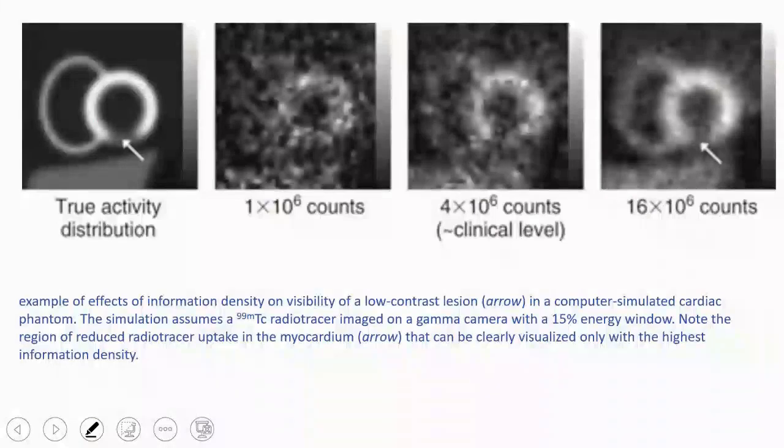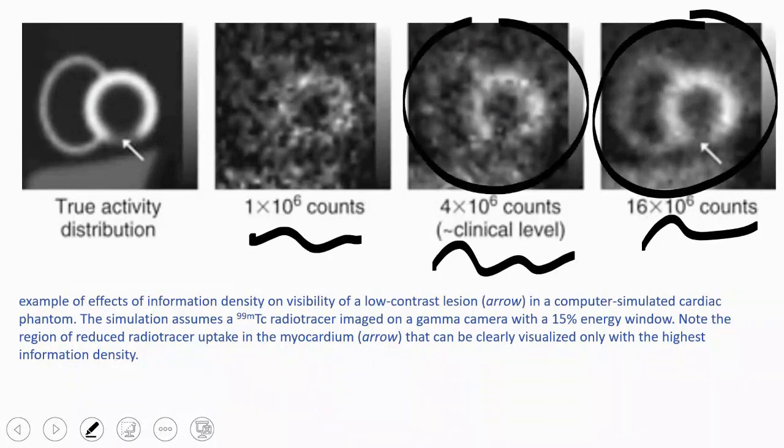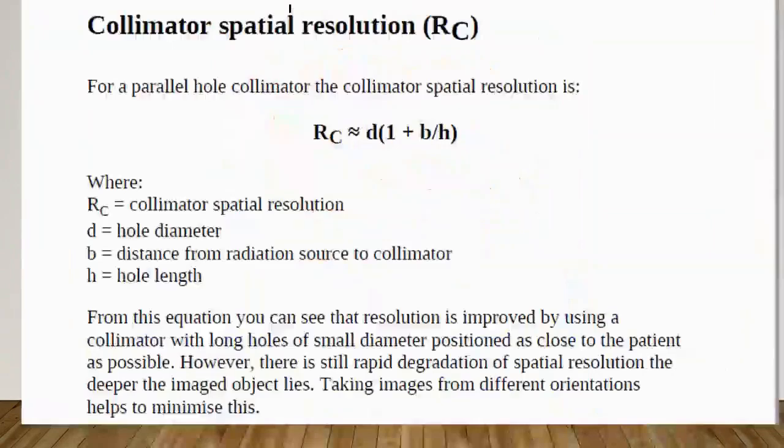The same idea applies. If there is a problem with the sensitivity, then the counts produced by the detector will be weak. I will show you the image that you created. Here with the high counts is a quick image. Here with the closest sensitivity, here the sensitivity is much lower. Therefore, you must perform quality control for this matter. This has a very good effect on the quality of the image. Consequently, it affects the diagnostic accuracy.